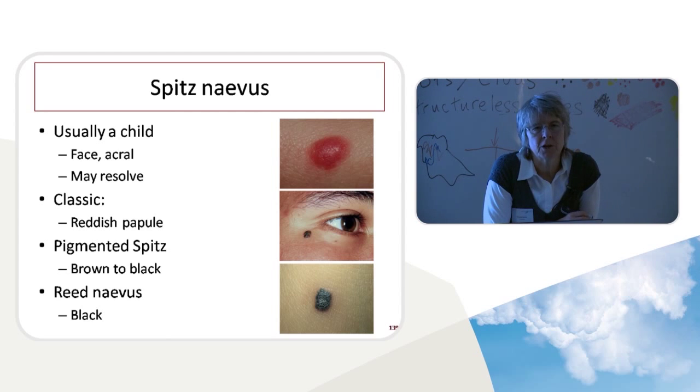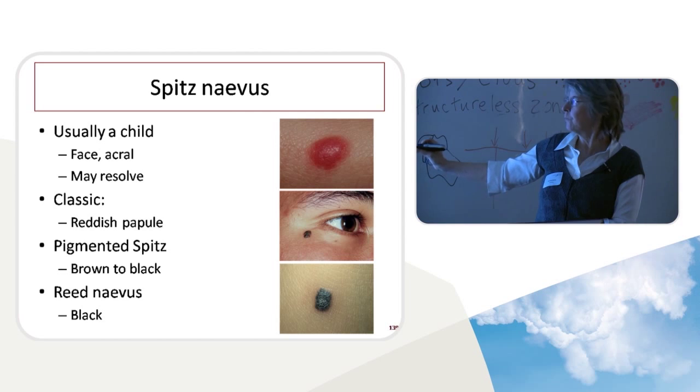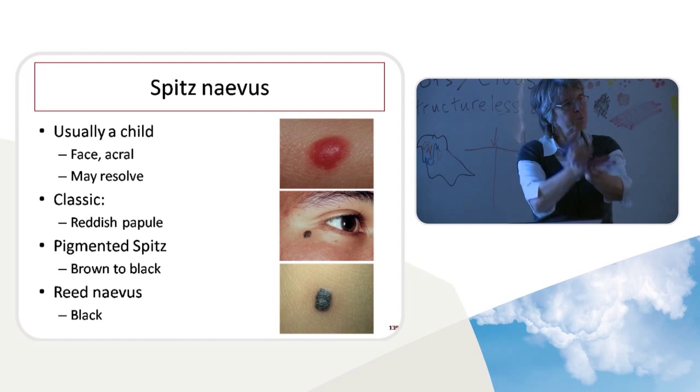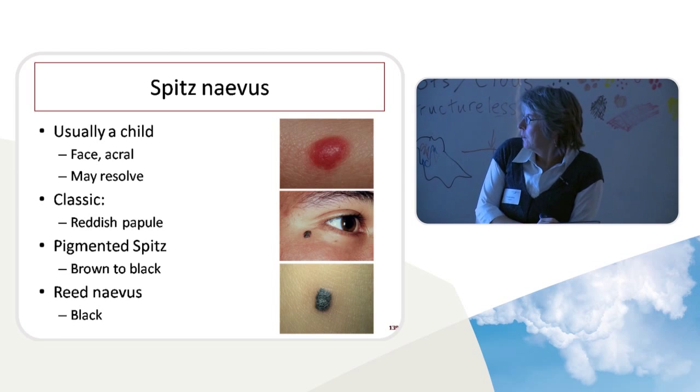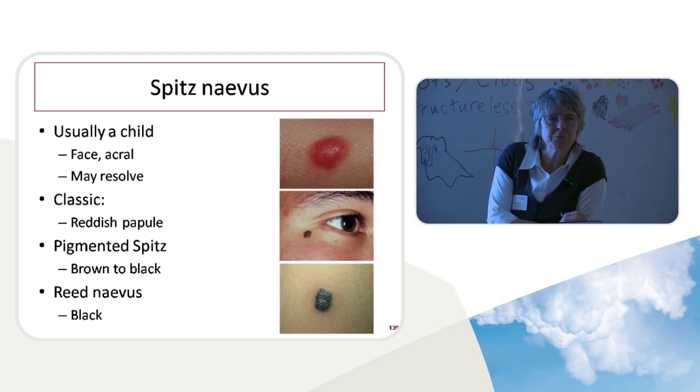But the reasons for that are not medical, they are philosophical, psychosocial and other. And don't believe the pathologists, as we've just heard. They don't know. They go on the architecture. So if it's very benign looking, like here we have a nice architecturally benign looking papule, same under the pathology, the architecture's benign looking, it's benign. But it's not easy. So you have to take it on an individual case, and in primary care I would certainly shift the blame to secondary care. Don't do the surgery yourself, refer on.